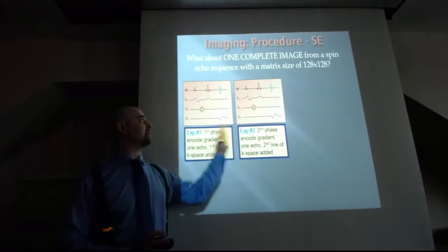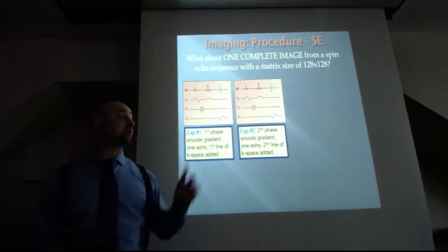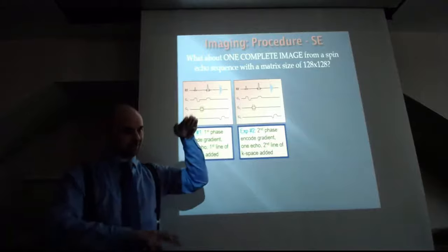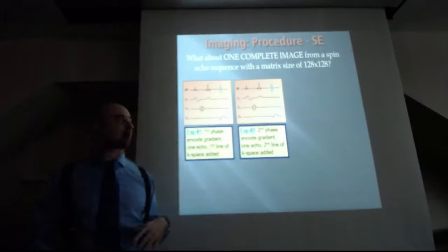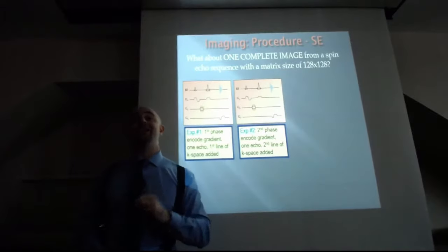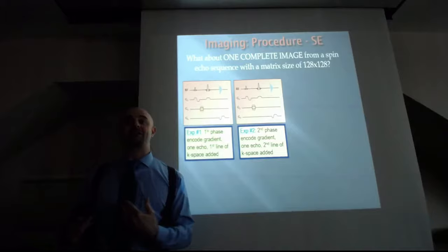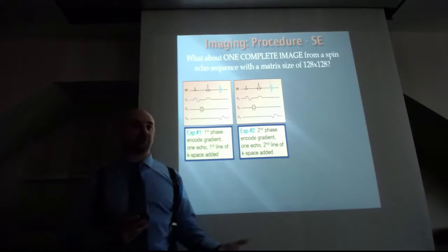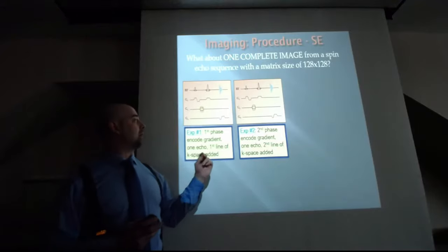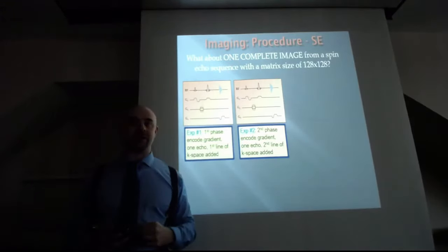In this experiment, the beginning is the same, but notice I've put the yellow lines in a different place, which also explains why this phase encoding symbol always looked like a hamburger or a multi-layered cheeseburger with all these different stacks on it. It's because the phase encode gradient in each MR experiment is necessarily distinct. It has to be different, right, in order to achieve spatial localization, as we talked about 2 weeks ago. Okay, so for the second experiment, use a different second phase encode gradient.